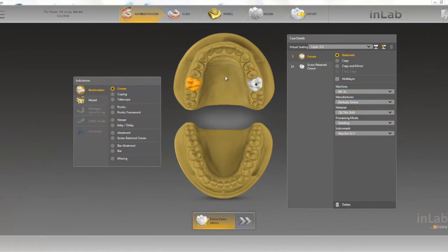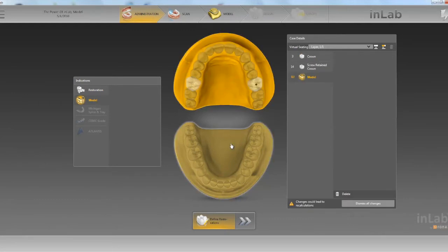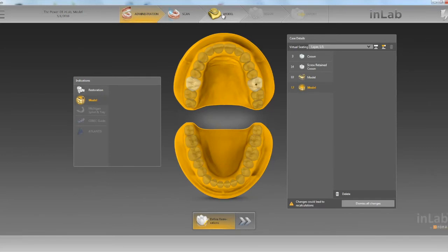We also want to create a model for this case, so we'll click on model. We'll choose the upper and lower model. After we've done that we can now head to the model phase.